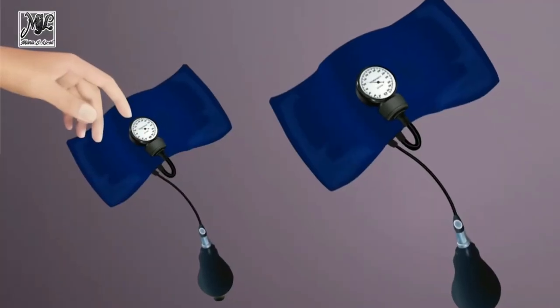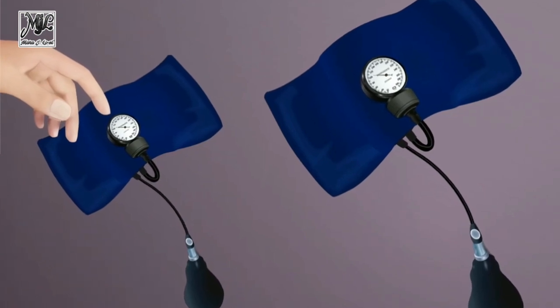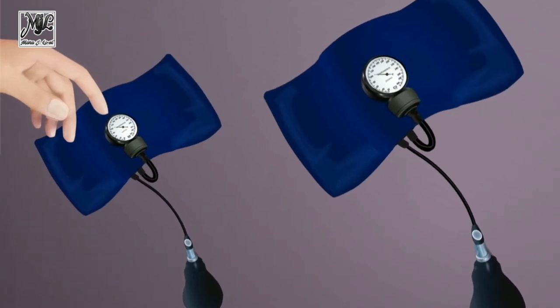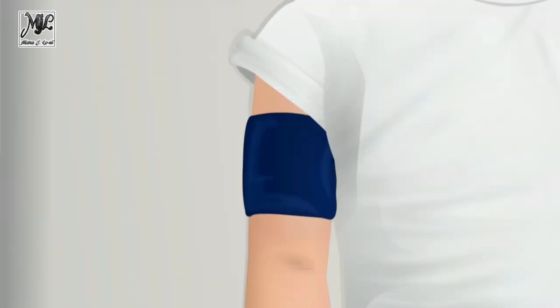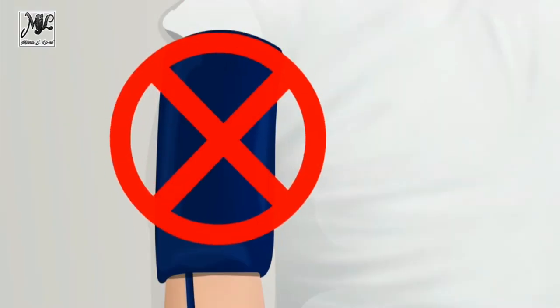For children through adolescence, available cuffs should include pediatric cuffs of varying sizes, a standard adult cuff, a large adult cuff, and a thigh cuff. Neonatal and infant cuffs are available in a variety of sizes. Do not use a cuff that is smaller than appropriate, as doing so can lead to false high BP readings. Do not use a cuff that is wider or larger than appropriate, as doing so may produce false low readings.